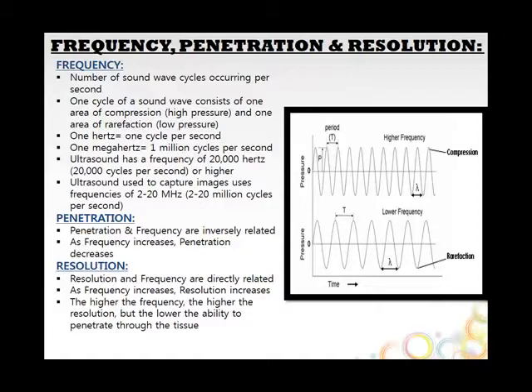So usually in breast imaging, we cap out somewhere between, I've seen 16 megahertz used, but you start losing your ability to penetrate. So usually 12 to 14 megahertz is what we want to use. It depends on what transducer you're using, like how much you're penetrating. So usually intercavitary probes have a little bit lower frequency, but a little bit higher than curvilinear. So it just depends. So not over 20?